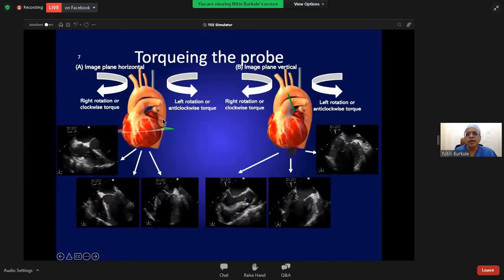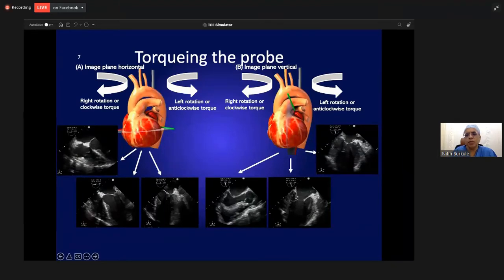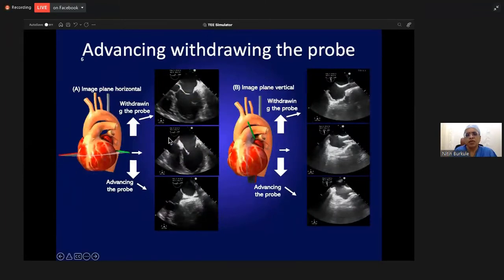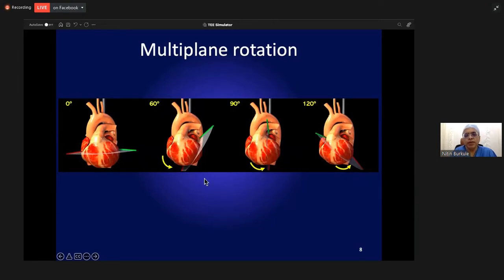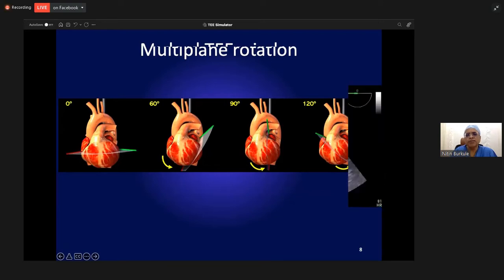What is more interesting is that there are a few simple movements, like say torquing the probe to the right brings the right sided structures, torquing the probe to the left brings down the left sided structures. Just advancing or withdrawing, one can see the superior structures and inferior structures. And not only that, but by using a multiplanar rotation, we can get extraordinary 2D planar views of the heart. So we have got the entire 360 degree view of the heart, which we can utilize for diagnosis and also for guiding a lot of interventions.